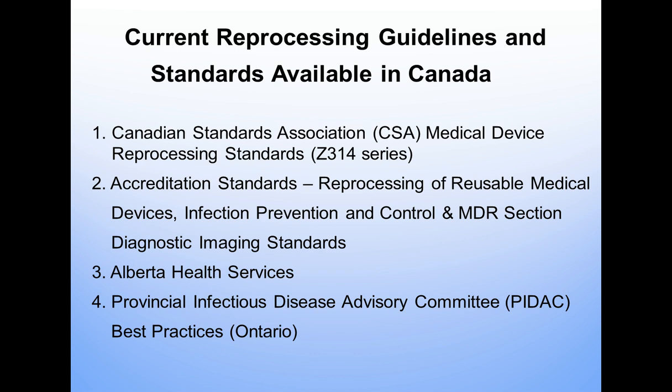So to talk a little bit about current reprocessing guidelines in Canada, there are many, and most of these you may or may not be aware of. I think those of you who are sonographers or technologists in the ultrasound diagnostic imaging departments, you're certainly familiar with your own standards. But the Canadian Standards Association Medical Device Reprocessing Standards, the Z314 series, sums up everything with regards to reprocessing of reusable medical devices.